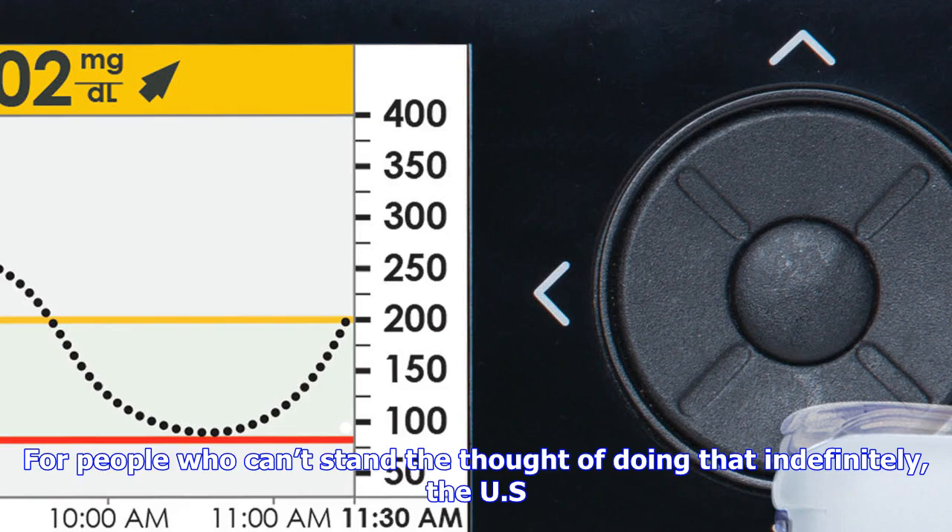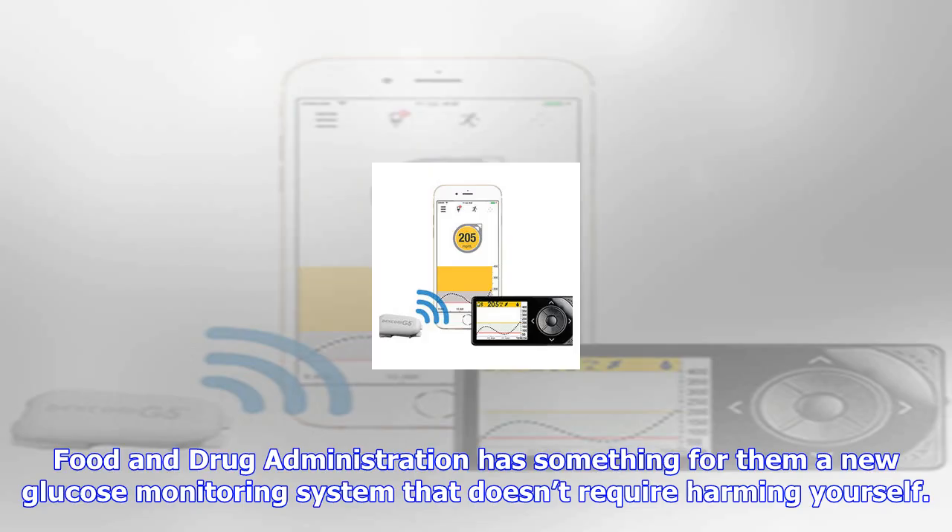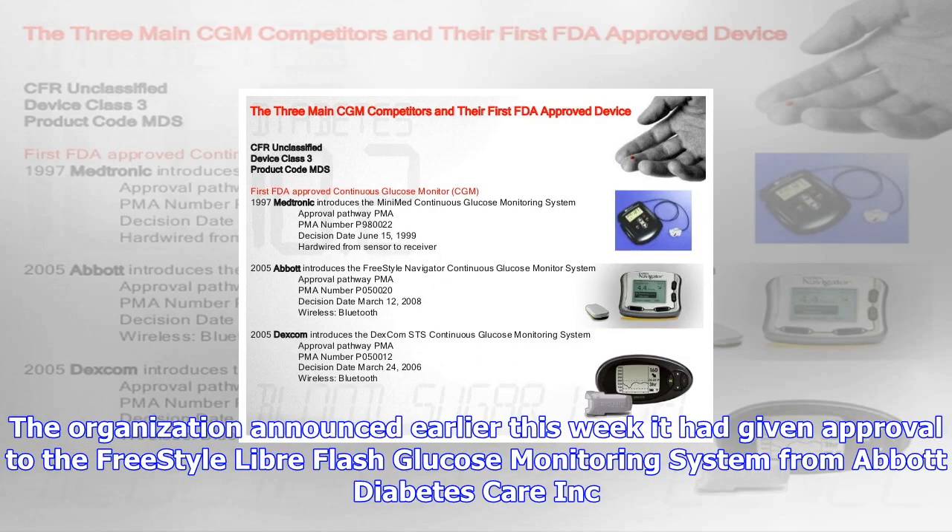The sensor continuously measures and monitors glucose levels. A mobile reader can be waved above the sensor to see if glucose levels are too high or too low. The new system is intended for adults over the age of 18. The FDA explains it can be worn for up to 10 days after a 12-hour initialization period. However, it's not capable of offering real-time alerts or alerting the wearer of low blood sugar levels.